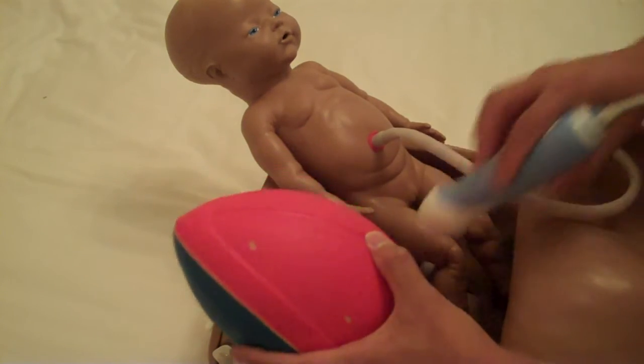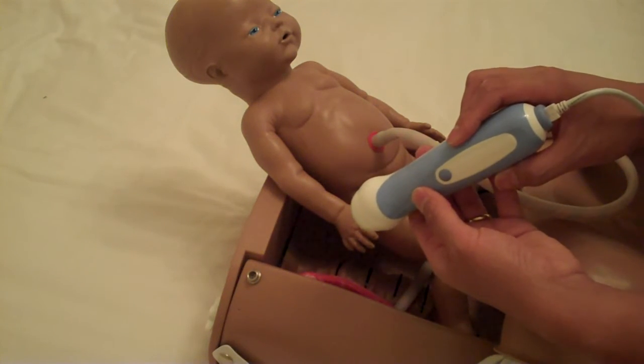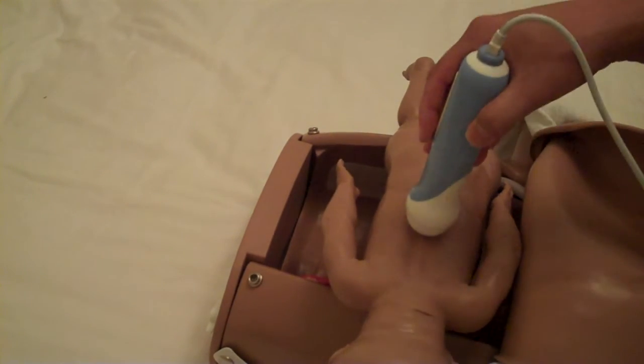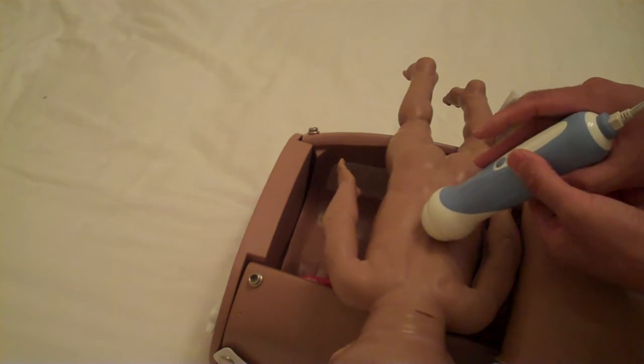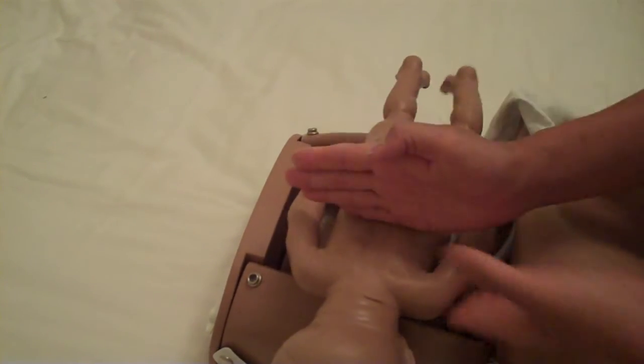So this is an example of where if you're looking at something and you simply just turn the probe, you get a completely different picture. The baby's body, or the trunk, can be thought of like that. It's either a cylinder or an oval. It's not a sphere. So let's say the baby is lying like this, and you're scanning with the dot pointing up. What are you going to see? Let's say you're scanning like this. Well, we're going to get a cut through here. So the cut through the body is kind of like a circle at that level, right? I think you can see that.